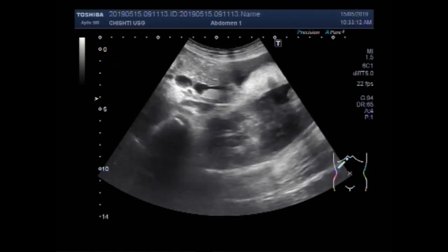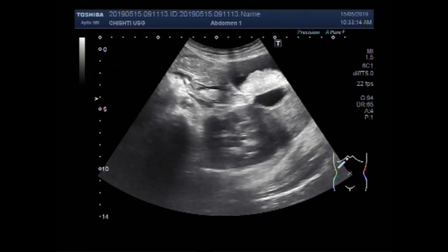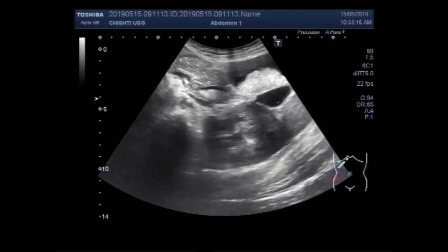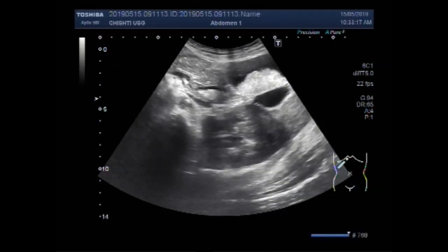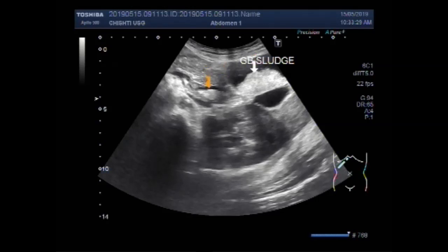Now you can see the biliary sludge. This is the sludge in the gallbladder. And this is the biliary sludge in the proximal portion of the bile duct.